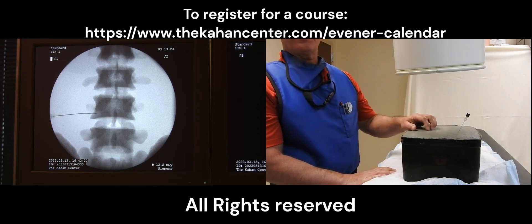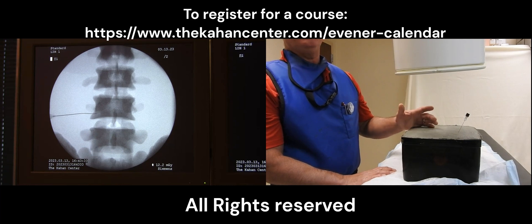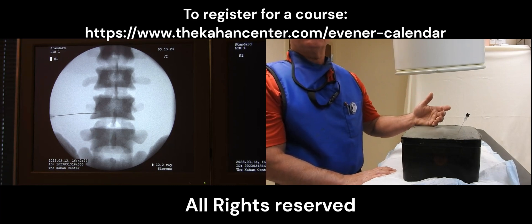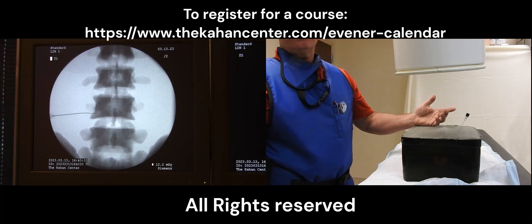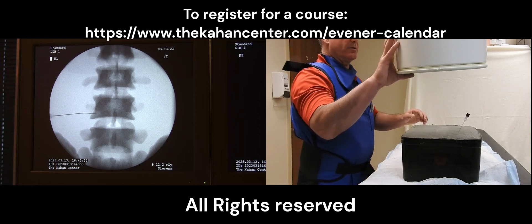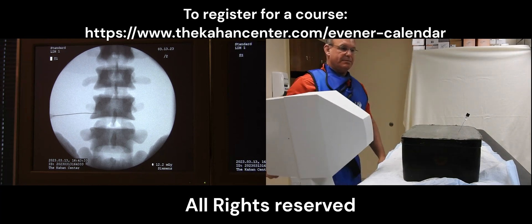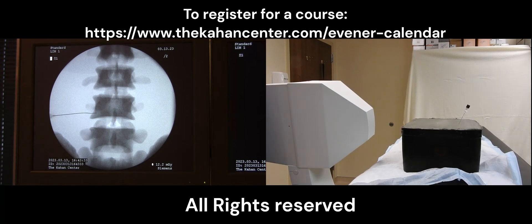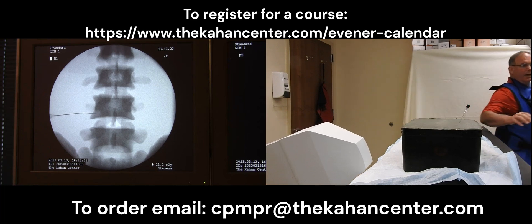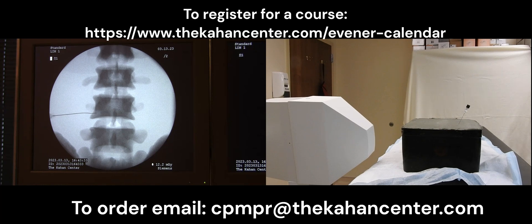Utilizing the biodegradable model I can practice this over and over again until I feel comfortable with my needle techniques. We can then check things with regards to PA views, oblique views, and lateral views to look at our depth as well as our progression from lateral to medial. For this we would go to a lateral view — simply raise the table up, lower our machine down as when you're working with a patient, and check your lateral views.